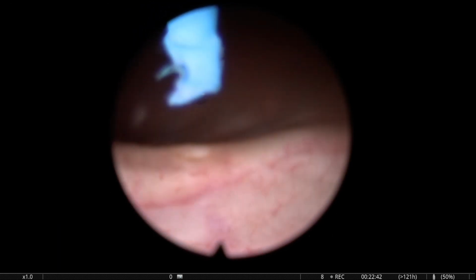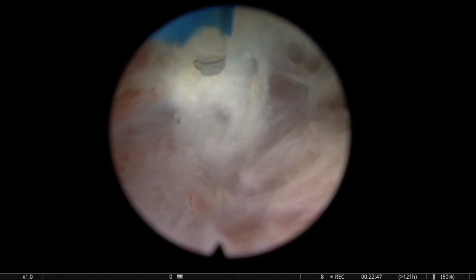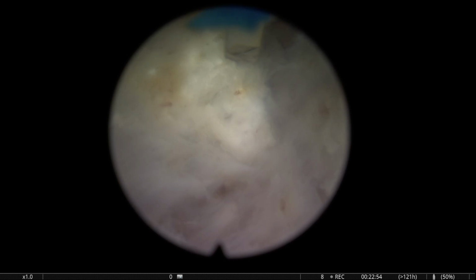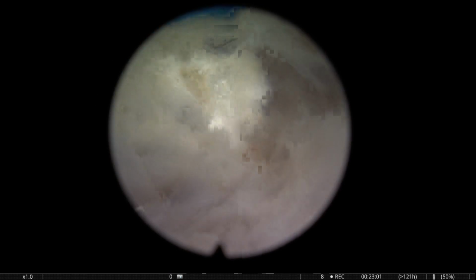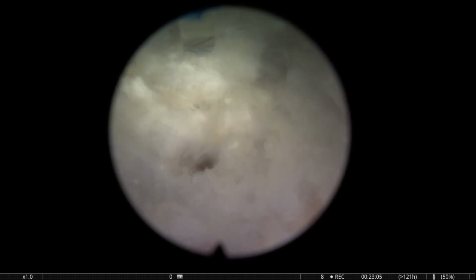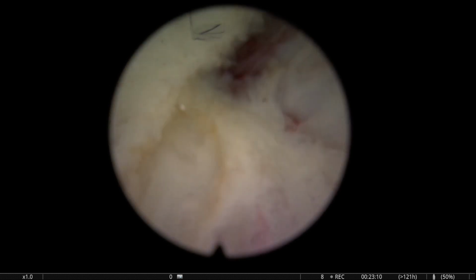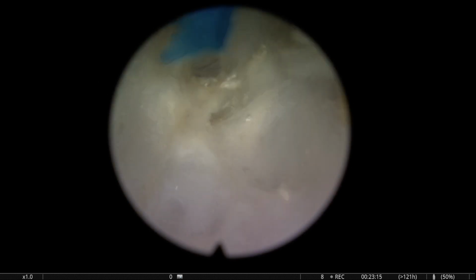Okay, we follow the line, but instead of firing against the line, because in this case you see the energy might go directly into the capsule, you need to keep close to the border, close to the side of the adenoma, you see, and then you are able to cut the attachments of the adenoma with the capsule, but only some coagulation takes place in the capsule. We're not using the energy in a way that the disruption can cause deep perforation.